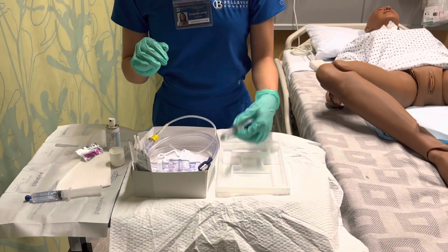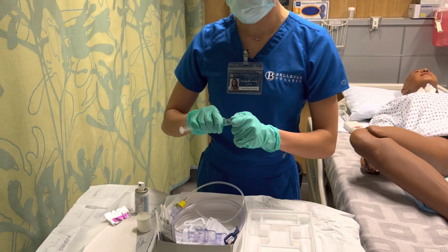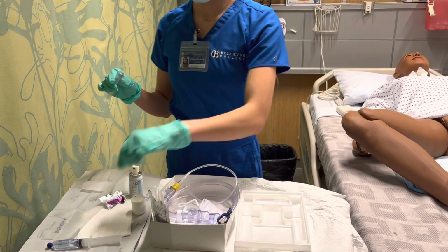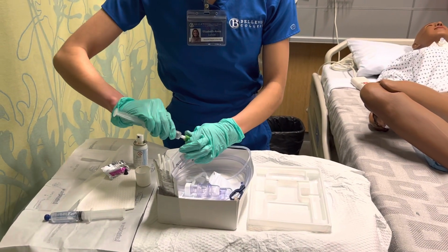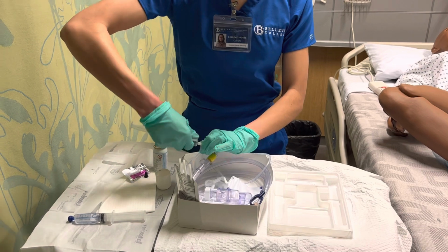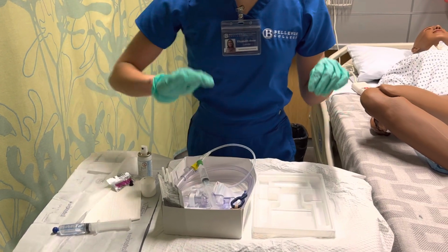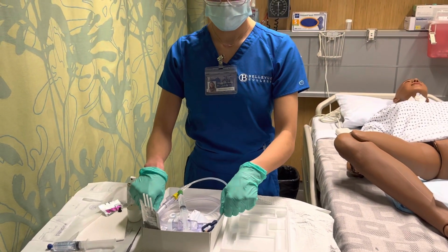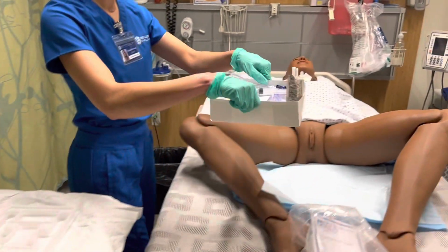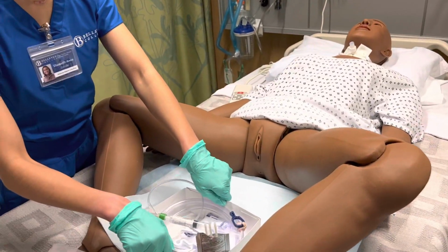And then we're making sure this is sterile water, so we're going to hook this up to inflate our balloon when that time comes. Okay, now we are all set. Take this to the patient. I can place this on my sterile field that I have here.